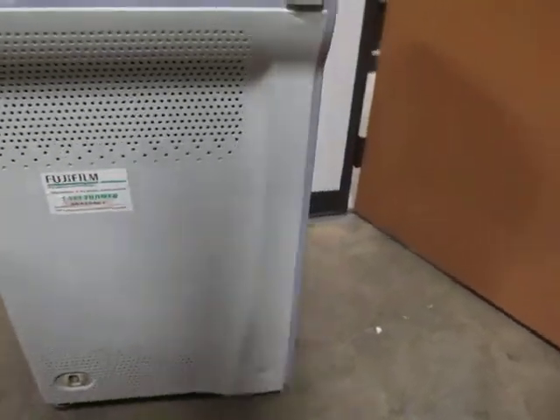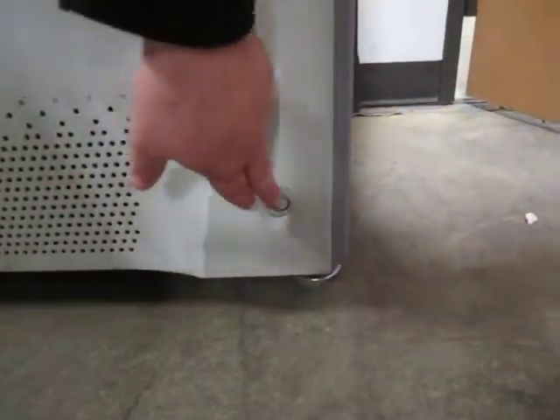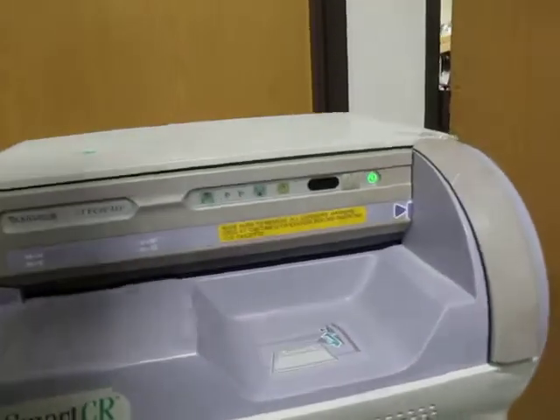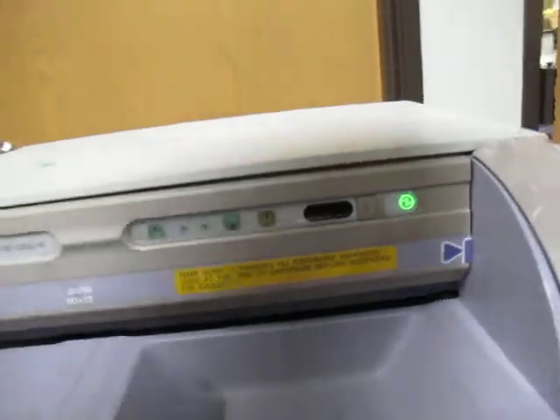There's a power button on the right side down here, and an on/off switch over here. Then there's this button which probably does more when you put the cartridges in.